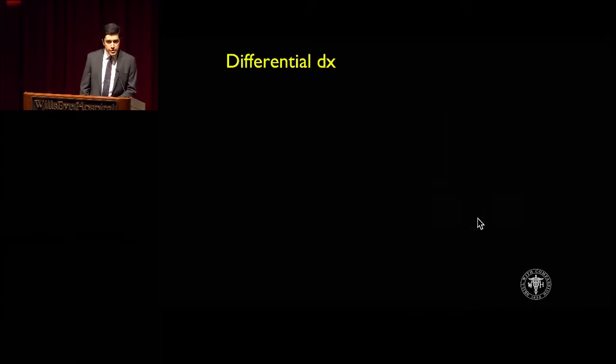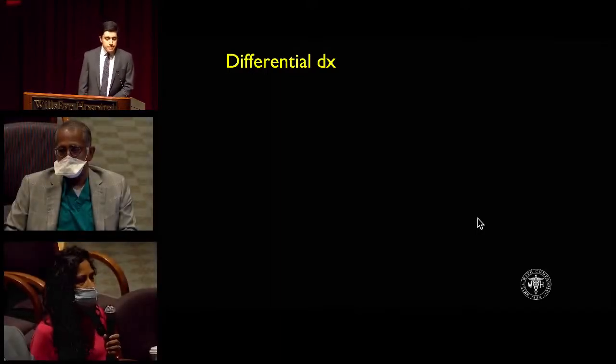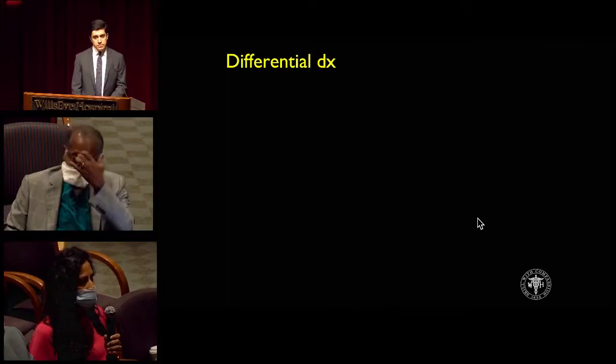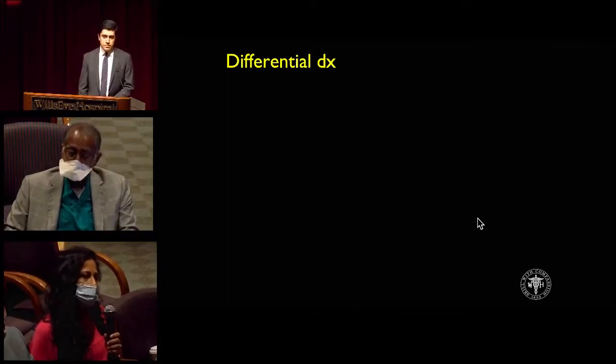So what would be your differential here? Yeah, so the first thing that comes to mind with those dilated and tortuous vessels and diffuse intraretinal hemorrhages, central retinal vein occlusion is the first thing I think of. He was 47, you said, so fairly young, which can make you think of hyperviscosity syndromes, where you can see this picture. Could think of hypertensive retinopathy. It is fairly asymmetric, so that would be atypical.